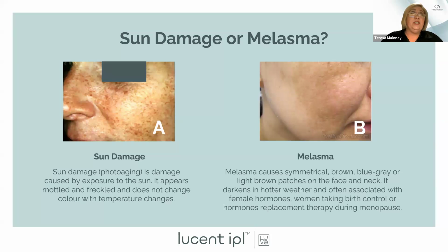One of the things I would remind you though, if you let it sit for an hour before you're going to activate it, because you do want to let it sit, what I would recommend is wiping it off as much as you could before you put the gel on, because you're just going to do it like a photofacial. You're just going to use the parameters that would be under their skin type and do it as a photofacial. But if you leave it on there, the gel will run off. So just make sure you've wiped it before you do that, and then you've activated it.